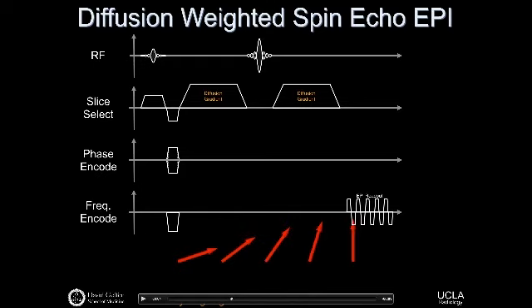And then if there's diffusion, the spins will actually exchange position. Right? So the spins themselves are labeled with the diffusion encoding gradient. They're given a certain amount of phase depending on their spatial position. But imagine also that those spins want to diffuse around. They can freely move.